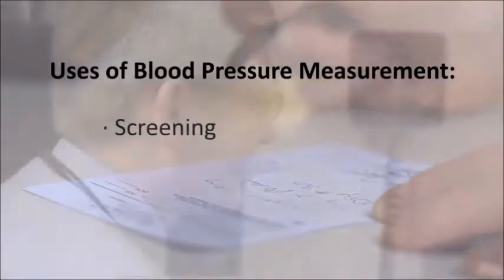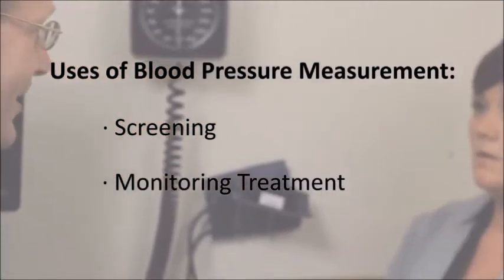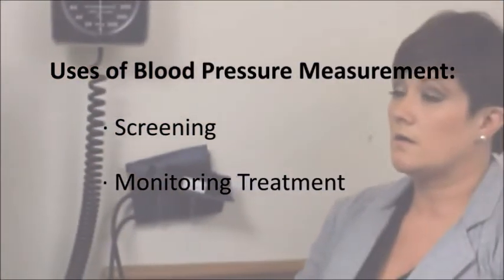Measurement of blood pressure is used in screening for hypertension and for monitoring the effectiveness of treatment for patients with a diagnosis of hypertension.